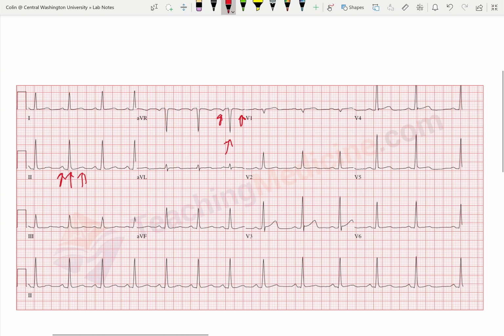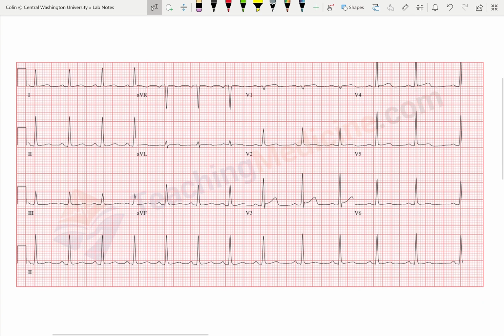And there is a certain issue that'll happen where you'll have a bunch of things that are negative and then AVR is positive, and that's a huge problem. So those people are usually going to die pretty quickly. So that's kind of camera angle 101.